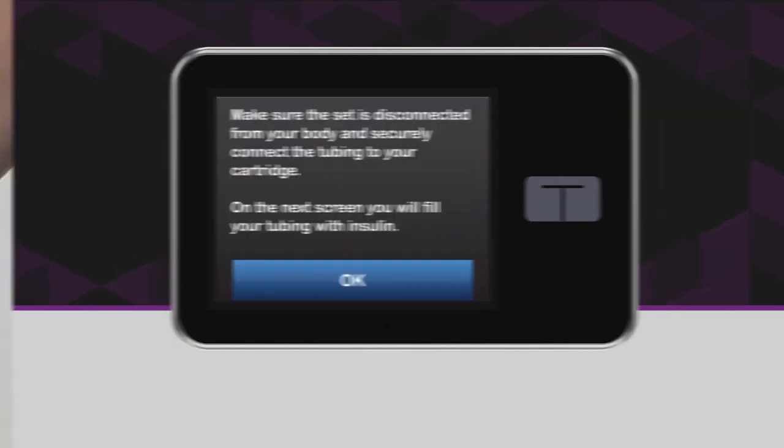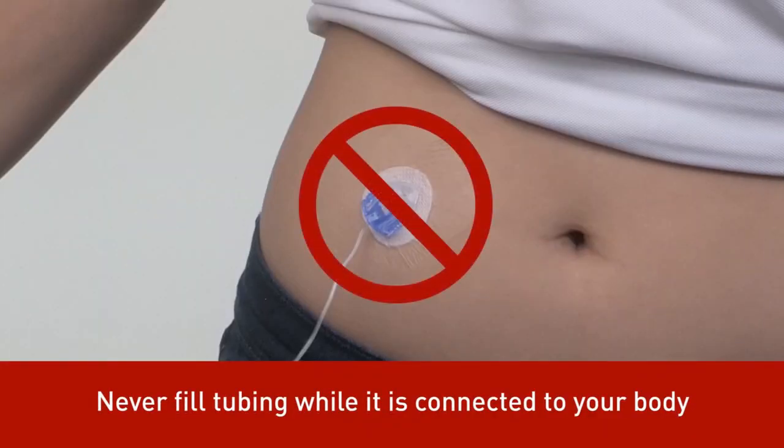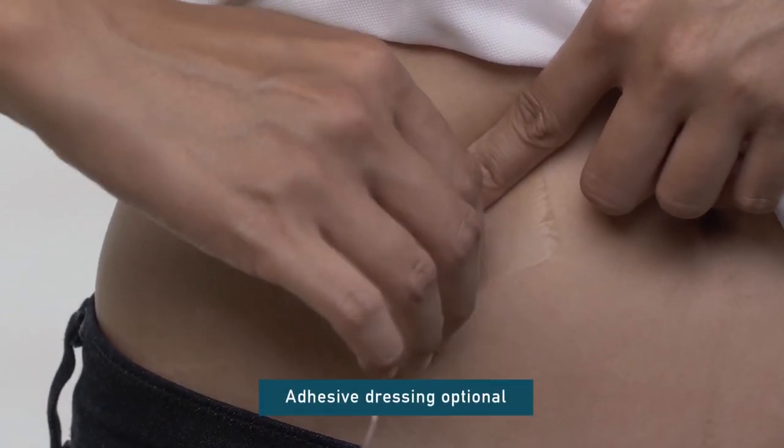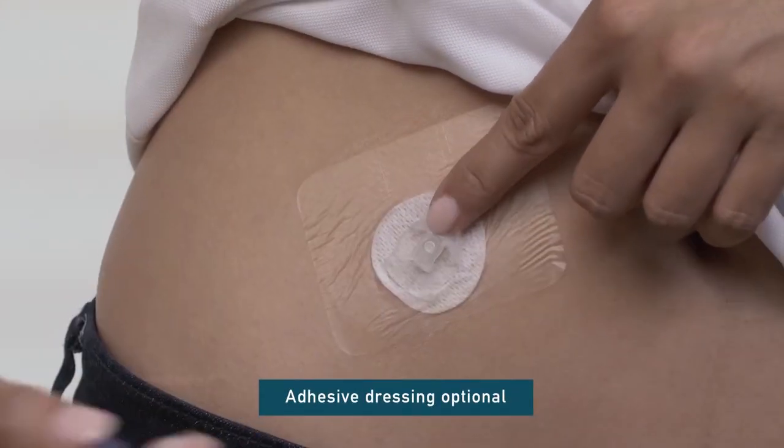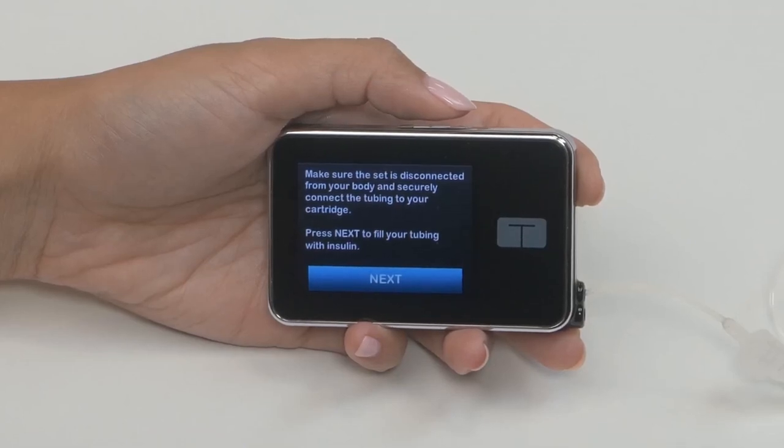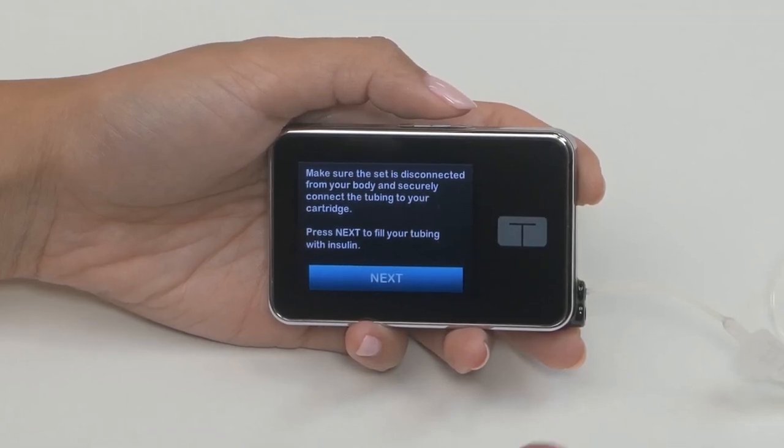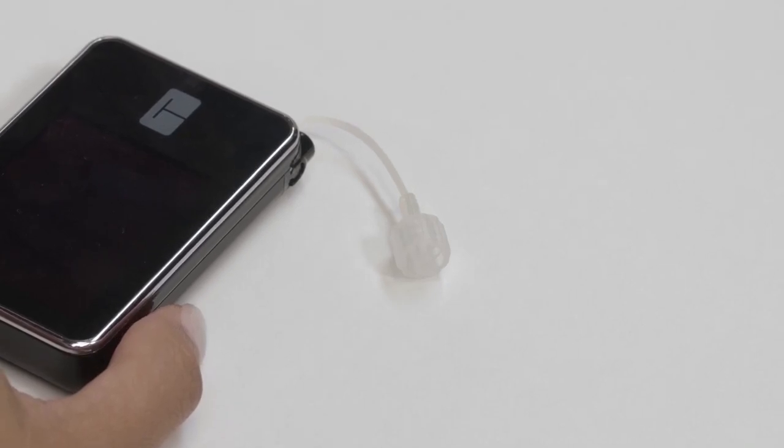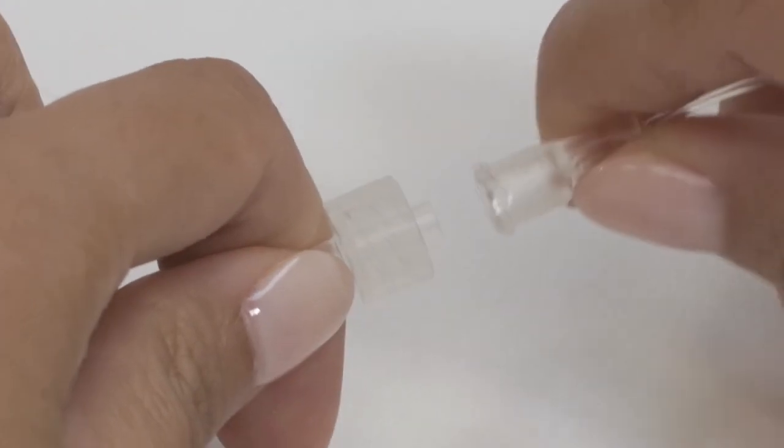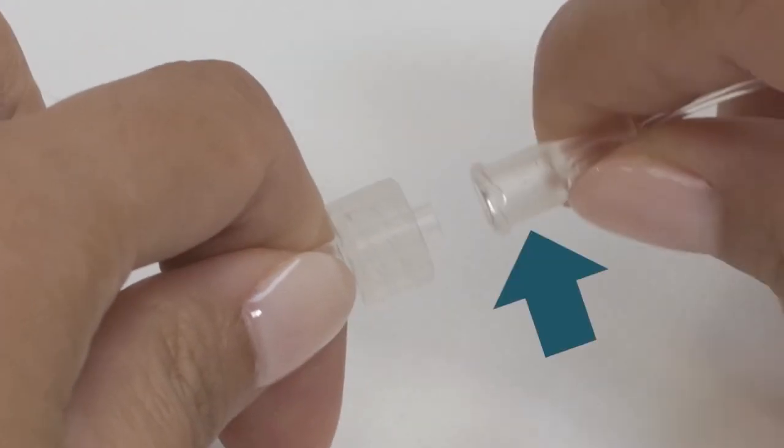Your pump will prompt you to fill your tubing with insulin. Never, ever fill your tubing when it's connected to your body. This could result in the unintended delivery of insulin. Always disconnect your infusion set from your body before you begin a load sequence. Your pump will remind you of this each time you tap Load. Before you can fill your tubing, you need to connect your tubing to the cartridge. Your infusion set may look different, but the tubing fill process is the same.